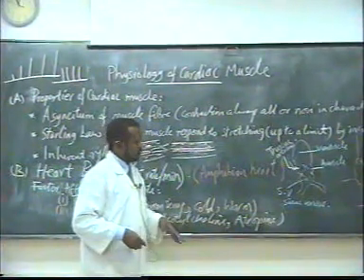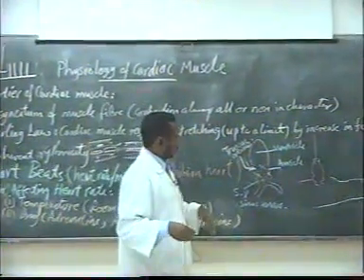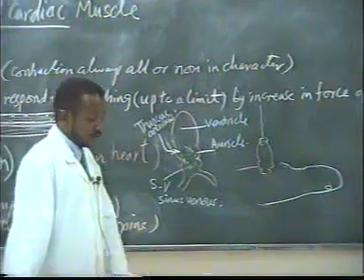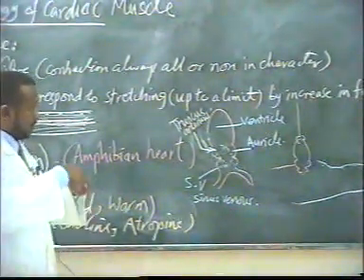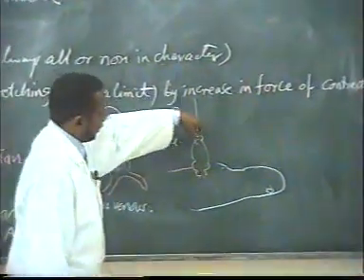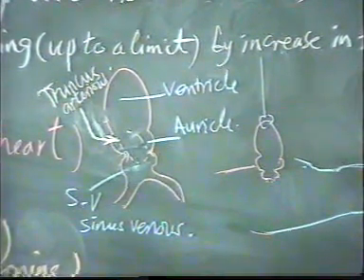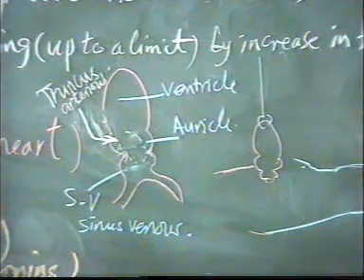As usual, we start by preparing the animal. You have to start by pithing the frog, and then we open the chest and the sternal region, and we expose the heart. We open the pericardium, and we fix the heart with a clip to the myograph, and as we recorded previously in the skeletal muscle, the same way we are going to record the contraction of the heart.